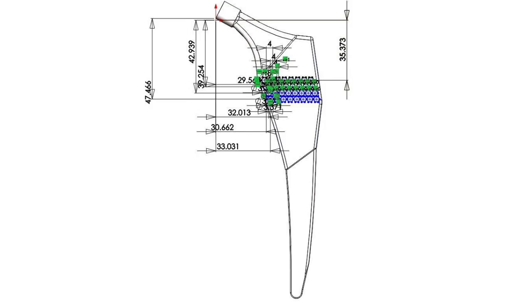This is my porous structure evaluation for my given femoral stem. As you notice, we have some objects or shapes, let's say, on the stem. These objects are for the porous structures which I created using CAD. The shape that is shown on the screen is a hexagonal shape which I consider to use throughout the implant on the given area to get the result for the porous structures. I also would be considering squares and triangles to get the results and see which of the objects would be best to use as a porous structure on a stem.